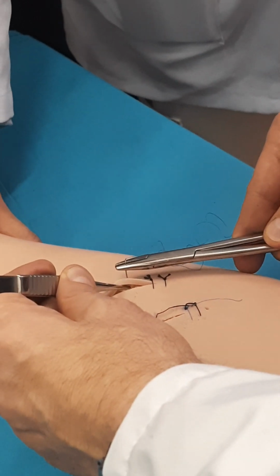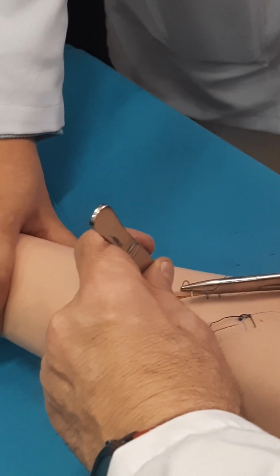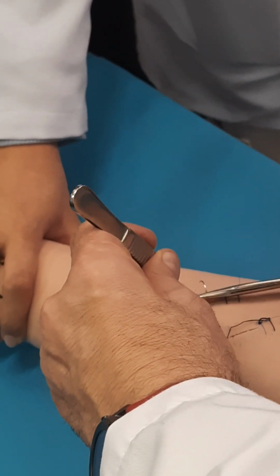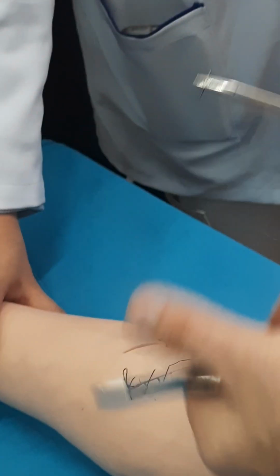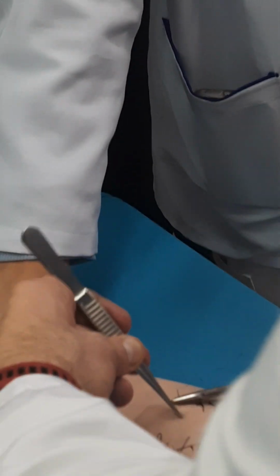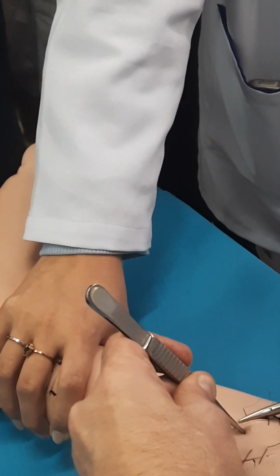You measure the piercing distance, half a centimeter as you can see. And your movement should be absolutely round. Look, absolutely round. Don't move it straight. Move it roundly. Again, I show you, I make the fixation. You put it, you measure. Don't pierce before measuring. Measure it, pierce it. Now, absolutely the same you do on the opposite side. You make fixation. Again, you measure the piercing distance.